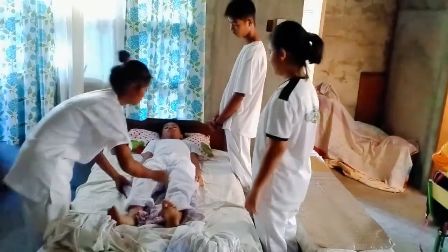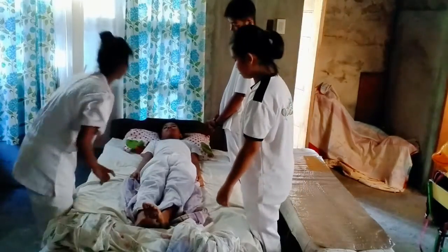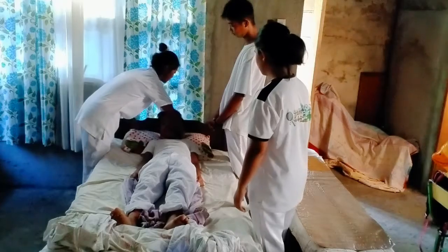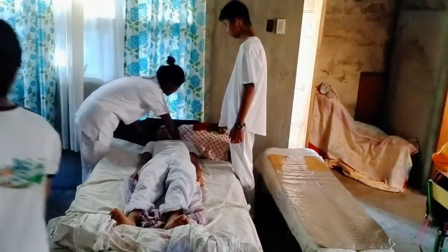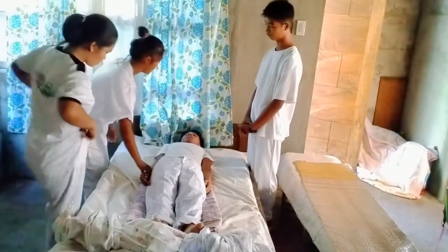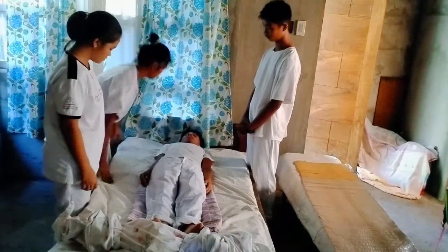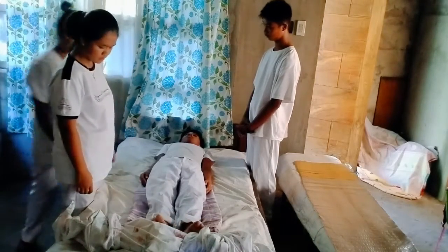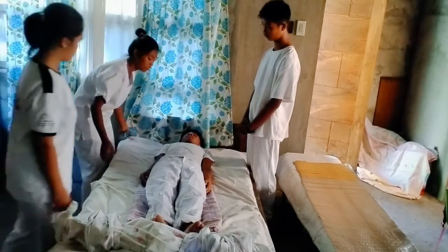Make sure the bed brakes are locked. Lower the head of the bed as much as the patient can tolerate. Support the patient's head while you remove the pillow. Next, lower the side rail on the bed, cross the patient's arms, and help her cross her ankles.